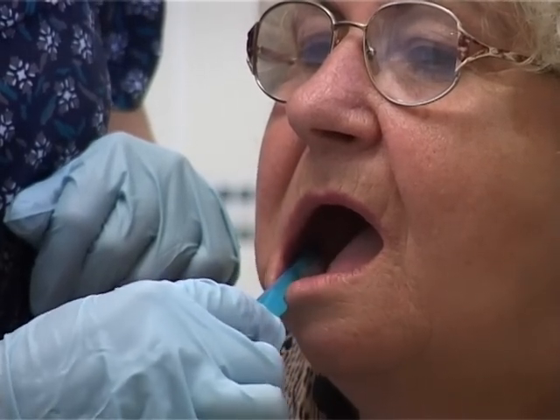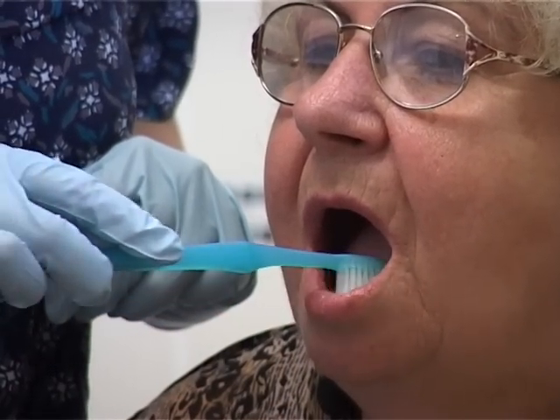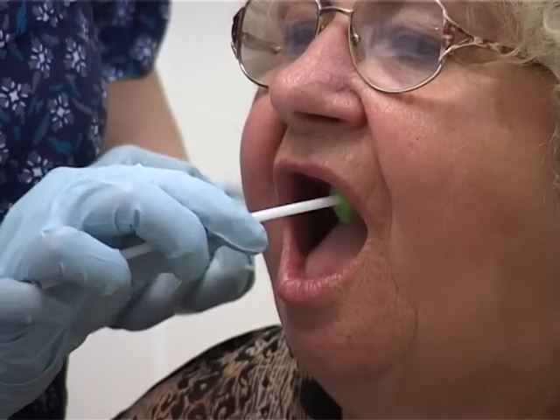Once the dentures are out, clean the mouth with a soft toothbrush, or if the gums are very sensitive, use an oral swab.